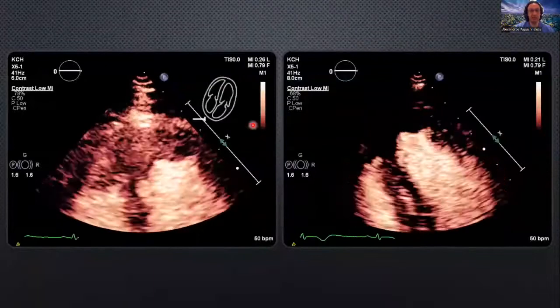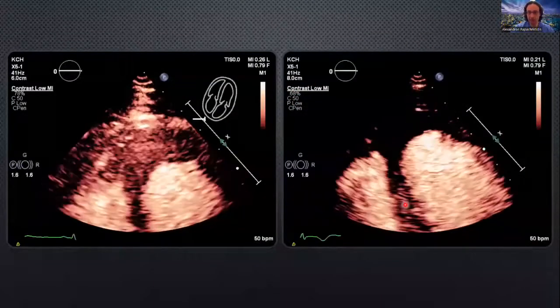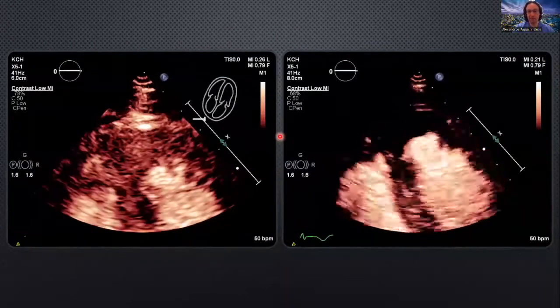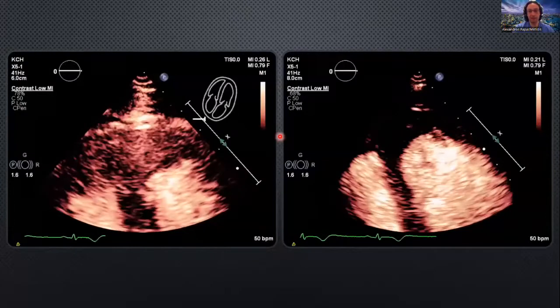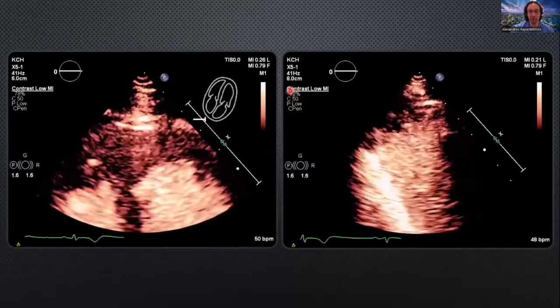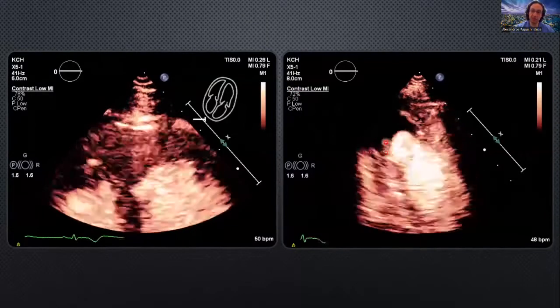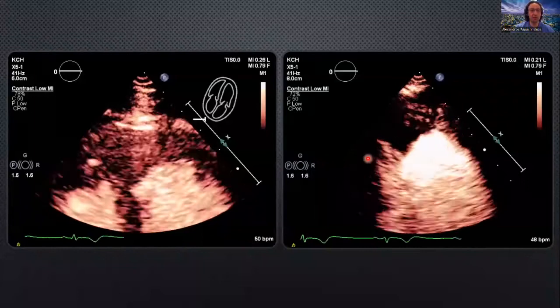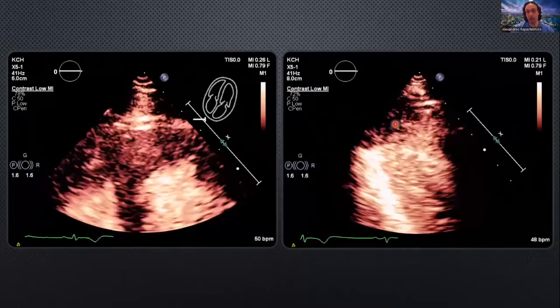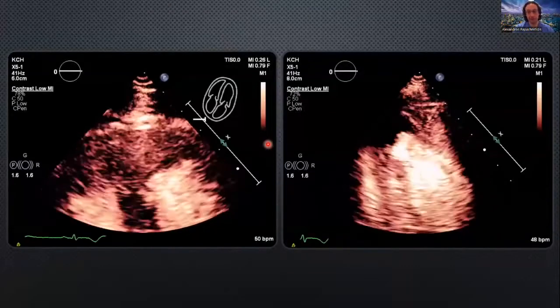It's definitely thrombus. As you have some space, you can increase your gain a bit more. You get a better appreciation of the perfusion in the myocardium, and you see how it discriminates nicely from the non-perfused thrombus. So here you bring the gain to 70% with the same mechanical index, and you see how the thrombus now differentiates very nicely. There's no hesitation to call this a thrombus. There's no perfusion there, and you can see how it separates nicely from the perfused myocardium.